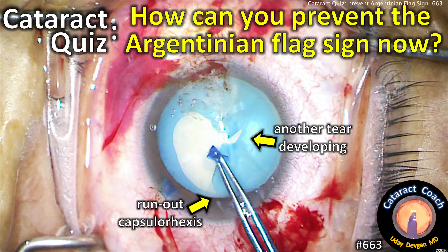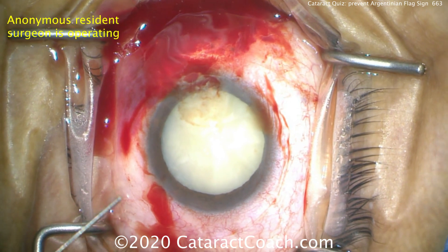CataractCoach.com. We've got a cataract quiz. How can you prevent the Argentinian flag sign? You've got a run-out rhexis and a tear developing.